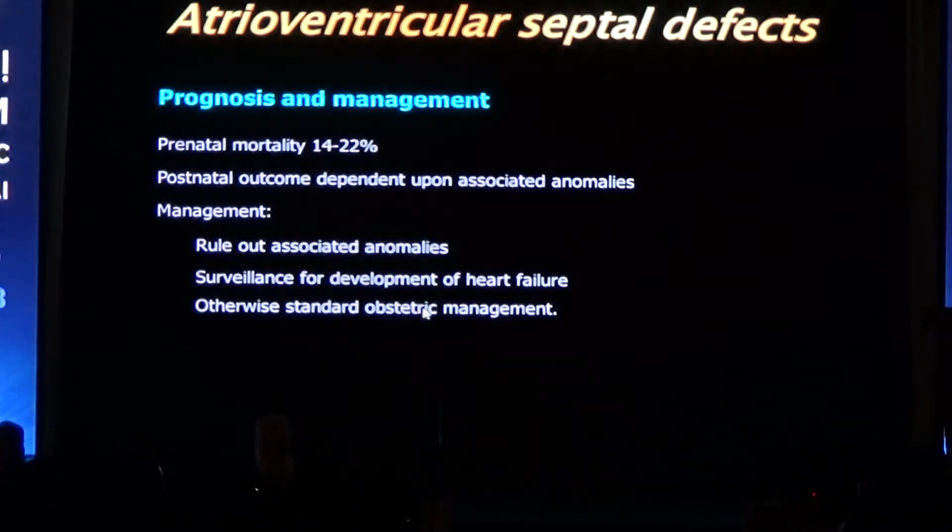So to summarize, atrial septal defect, two big forms. Ostium primum, you're missing the segment between the foramen ovale flap and the crux of the heart. Ostium secundum, you're missing the foramen ovale flap. For the ventricular septal defect, four forms. The inlet, outlet, and membranous are easy to confuse, but they're easy to differentiate from the muscular or trabecular form. Always do color Doppler to see the transfer of the blood during systole and diastole.